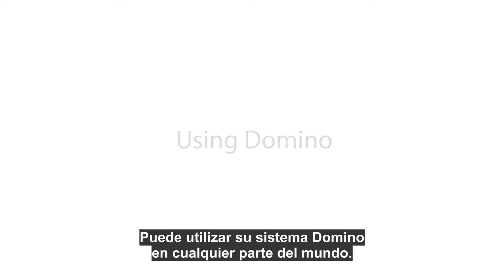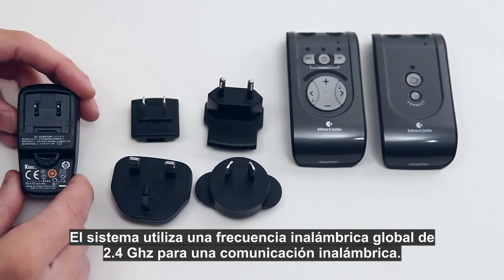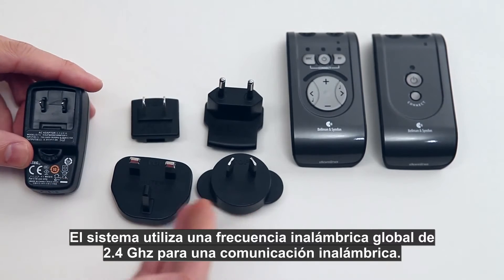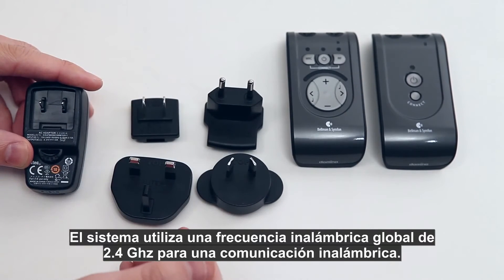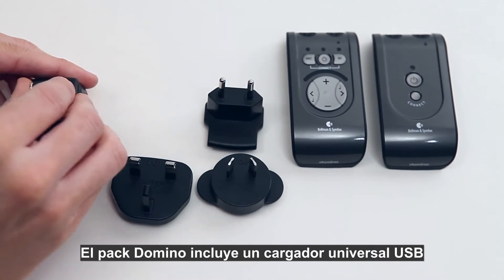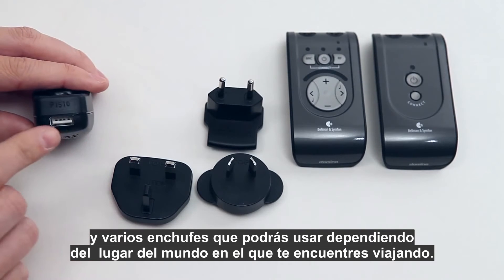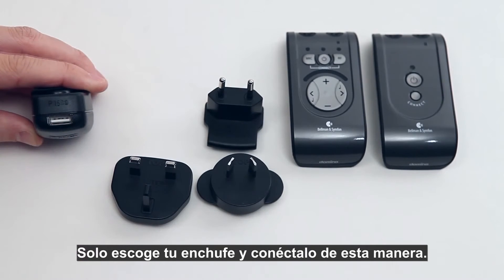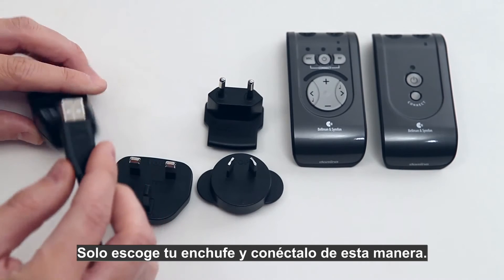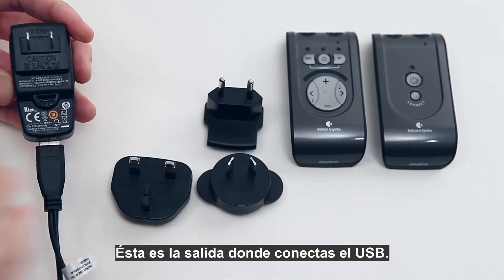You can use your Domino system anywhere in the world — the system uses the 2.4 gigahertz global frequency standard for wireless communication. The Domino package includes a USB universal charger and various plugs that you use depending on where in the world you are traveling. Just select your plug and connect it. This is the output where you connect the USB contact.